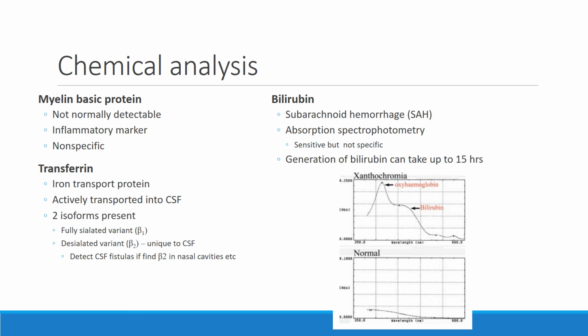The conventional testing that we use in our instruments isn't the same. You use the correct spec, the correct technology in the lab. Bilirubin levels would be so low in a CSF that our conventional testing won't work. So you have to use absorption spectrometry. And that means, with the spec, you have to look at the peaks between 450 and 460 nanometers.